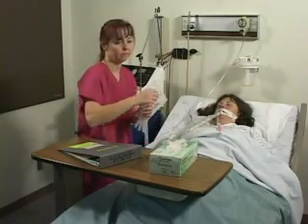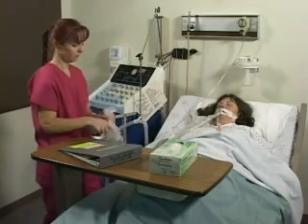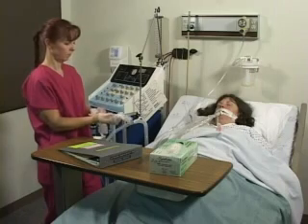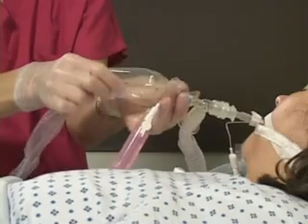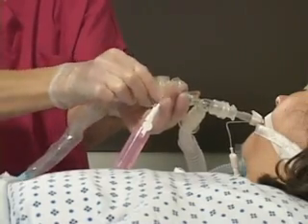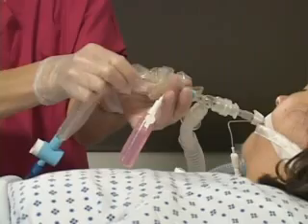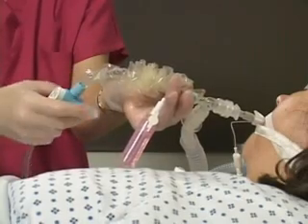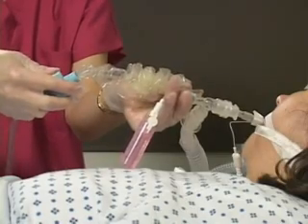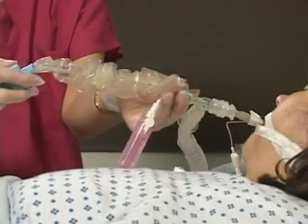Put on personal protective equipment as appropriate. This might include gloves, gown, and goggles or glasses. To minimize hypoxia, the catheter size should be no more than 1/2 of the diameter of the tube. Quickly but gently insert the inline catheter into the artificial airway without application of suction. Withdraw the catheter 1 to 2 centimeters to avoid suctioning tissue and apply intermittent suction while removing the catheter.